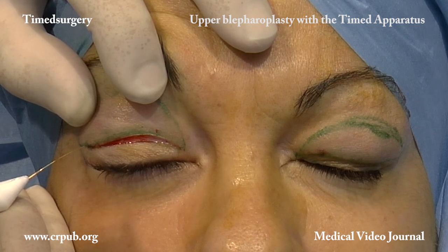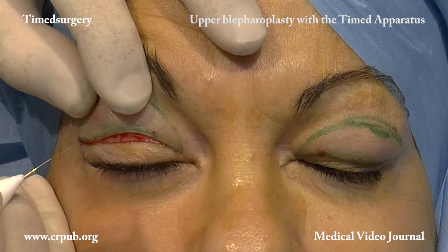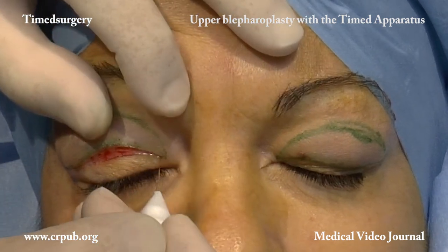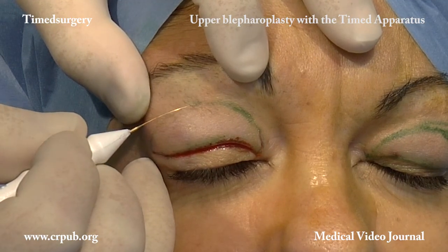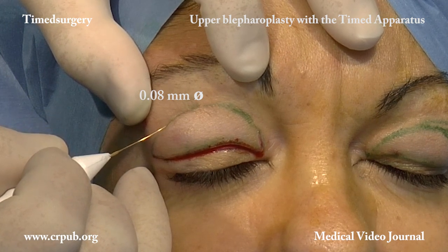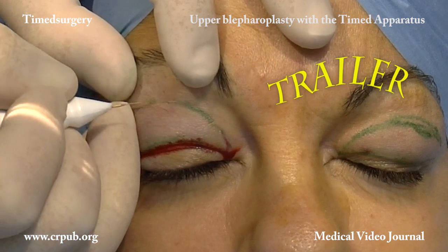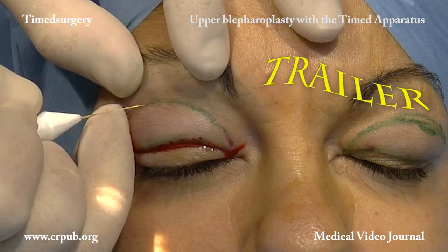The operator can choose whether to make the incision in the center of the preoperatively drawn line or at its upper or lower margin. This cutting technique enables precise millimetric excisions to be carried out in order to achieve the greatest symmetry. The timed apparatus is used for all the fine surgical procedures performed on the eyelids, from the excision of small neoformations by means of slow pulsed timed surgical cutting to upper and transconjunctival blepharoplasty.